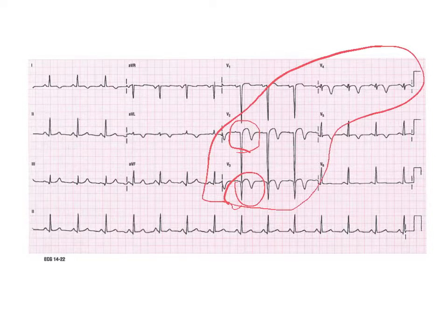So RPM, ABC, follow it every time, and don't skip around even when something dramatic pops up, particularly if it's in the C range. So that last thing that pops up is the first thing you see, but you need to make sure you do everything else all the way through.